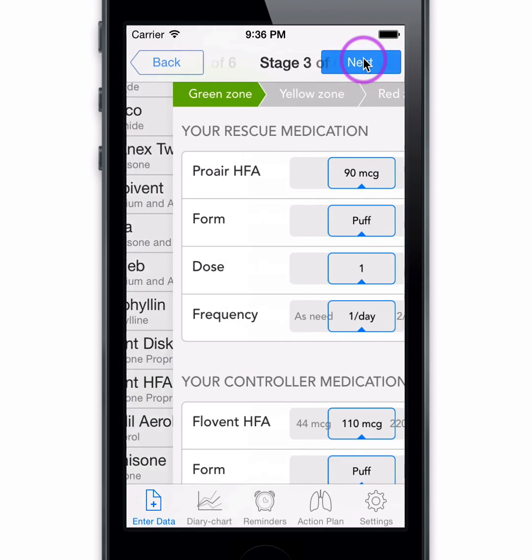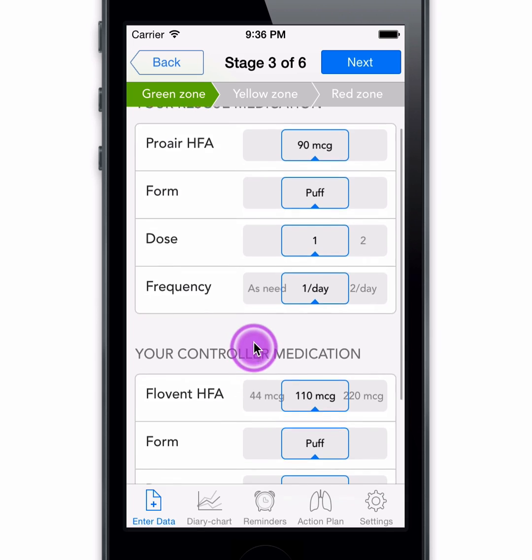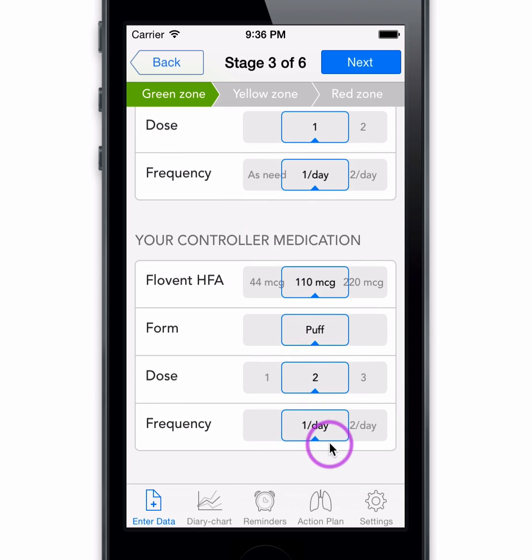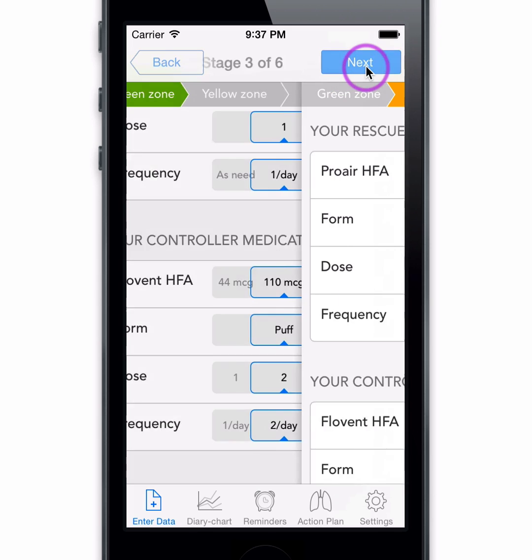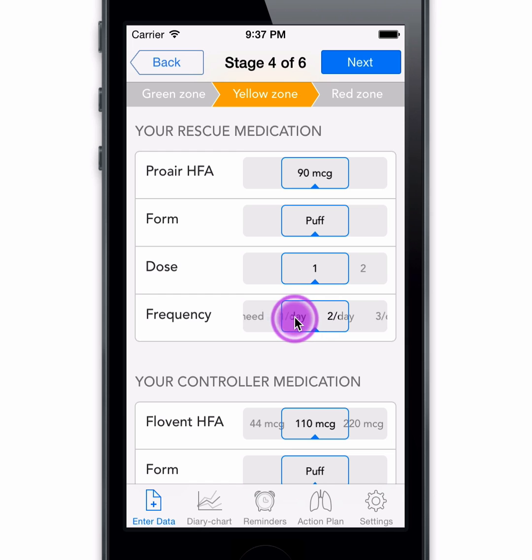Set your strength, form, dosage, and frequency. Set your medication for the green zone, and make easy adjustments to yellow zone and red zone.